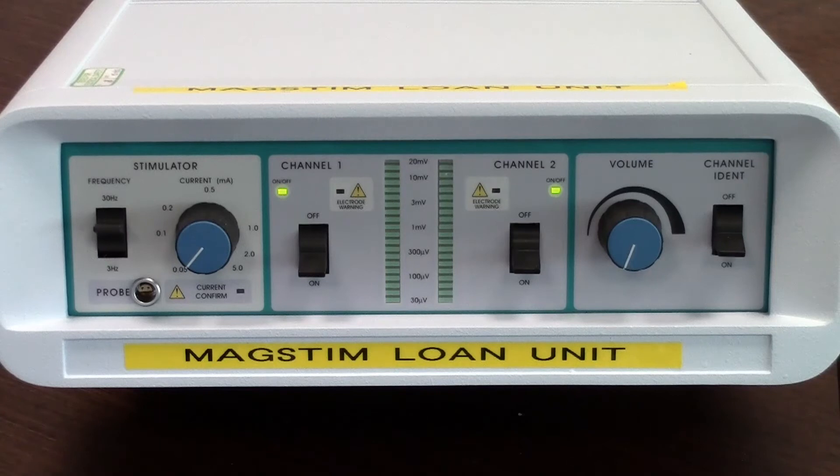To do a function test on the nerve monitor, switch the nerve monitor on at the rear panel. Followed by this, switch on the two channels 1 and 2. As you can see, no bar graphs have lit up.